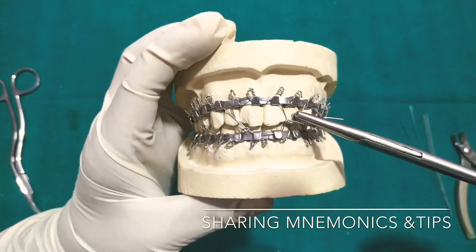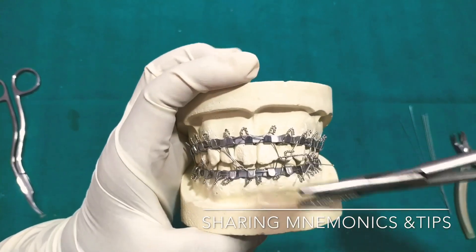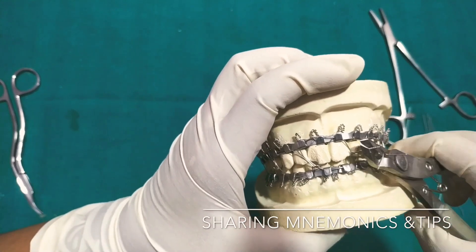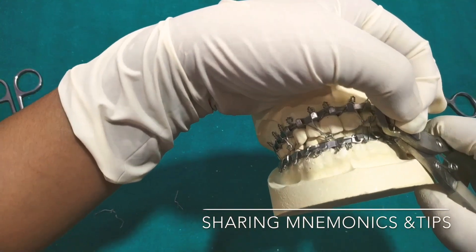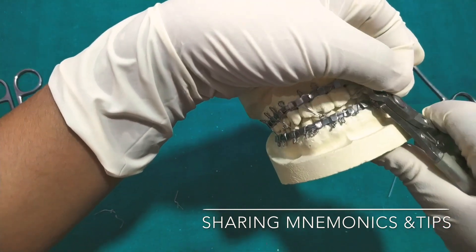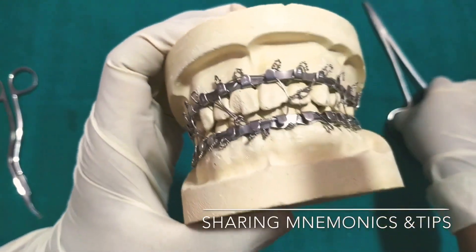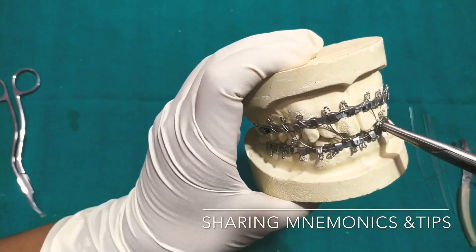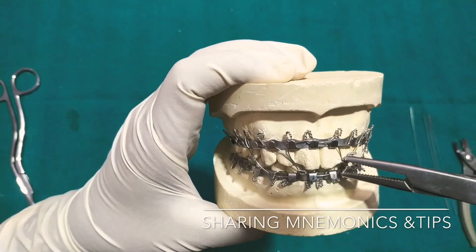You need to remember one thing: whenever you cut the wire, always hold it on this side — you can see in the video, I am holding it with my fingers — otherwise it's going to scatter here and there. Sometimes it's going to scatter into your eyes or your assistant's eyes, so it's very important to hold it. In my previous videos I haven't held it because it's just a cast, but when it's a patient, you cannot do that.